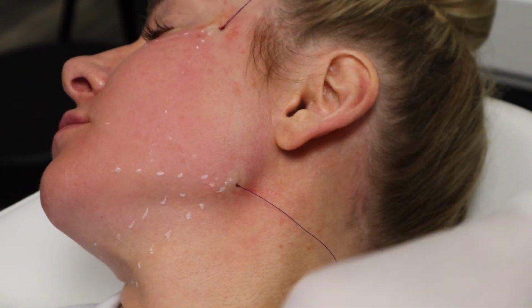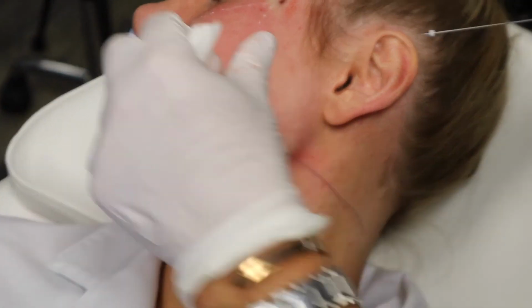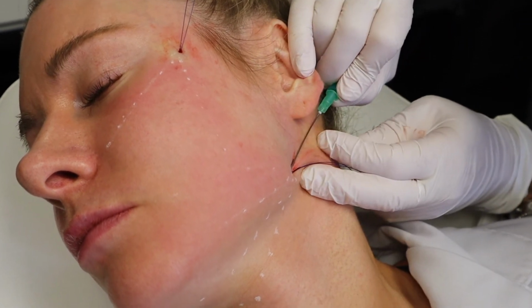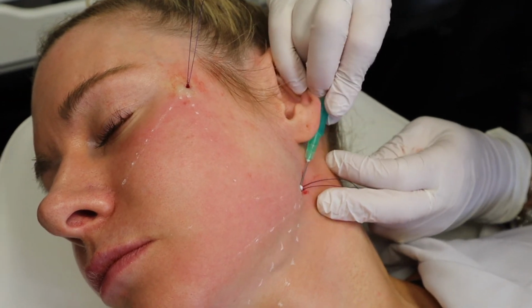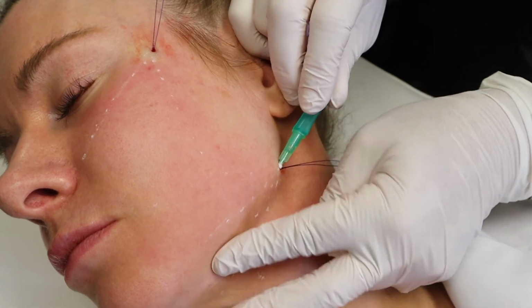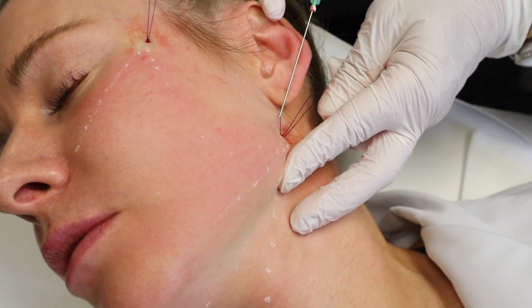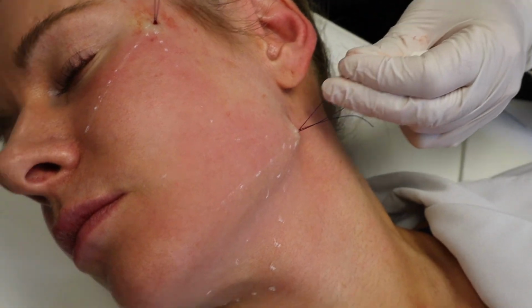PDO threads placed along the jawline can help restore the contour there and the structure that we often lose over time. By adding the threads under the jaw, we can also add contour there and head towards the submental area and create a pull there that can affect the neck tissue. PDO threads are the only non-surgical treatment that can effectively lift the tissue of the neck.